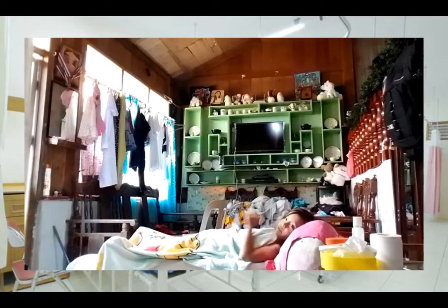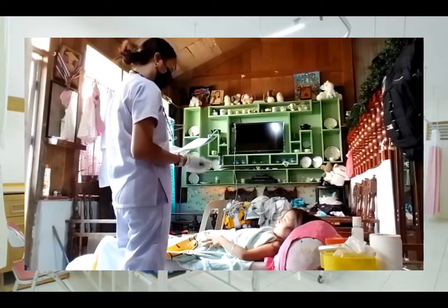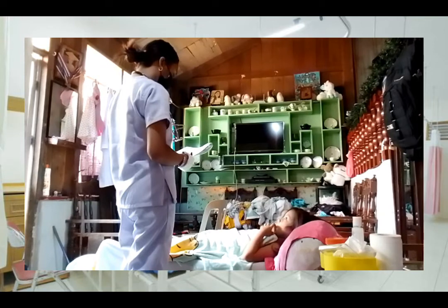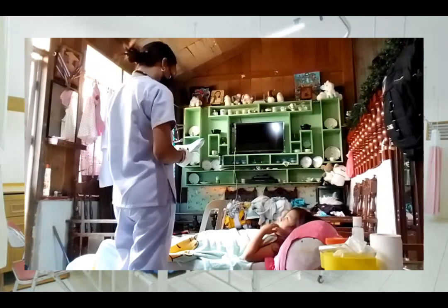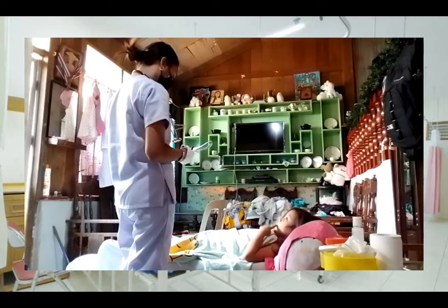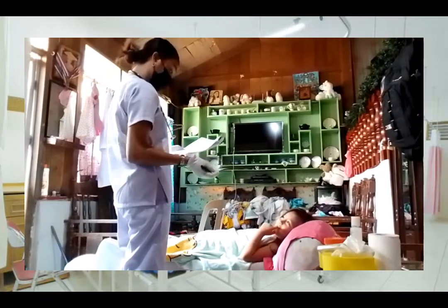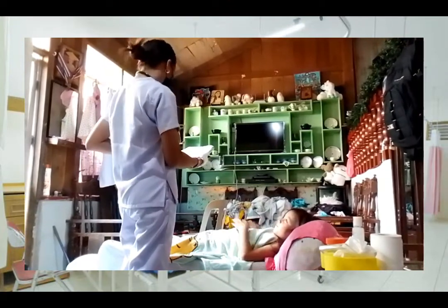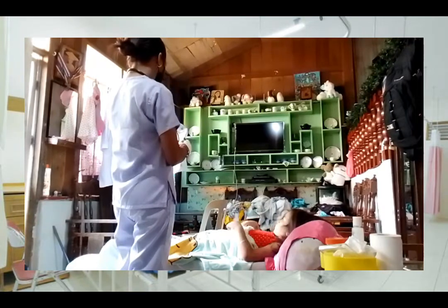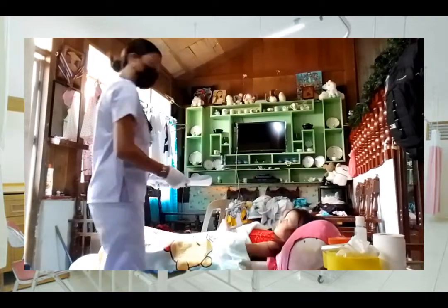Identify the client and explain the purpose of the procedure. Wear gloves. If the client is able to go to the bathroom, give him or her needed instructions. Provide privacy and place the client in mid or high Fowler's position. Place the bedpan. Ask the client to void first, and clean out urine from the bedpan. Put back the bedpan. Instruct the client to defecate, raise side rails, place the call light within reach, and leave the client if it is safe to do so.